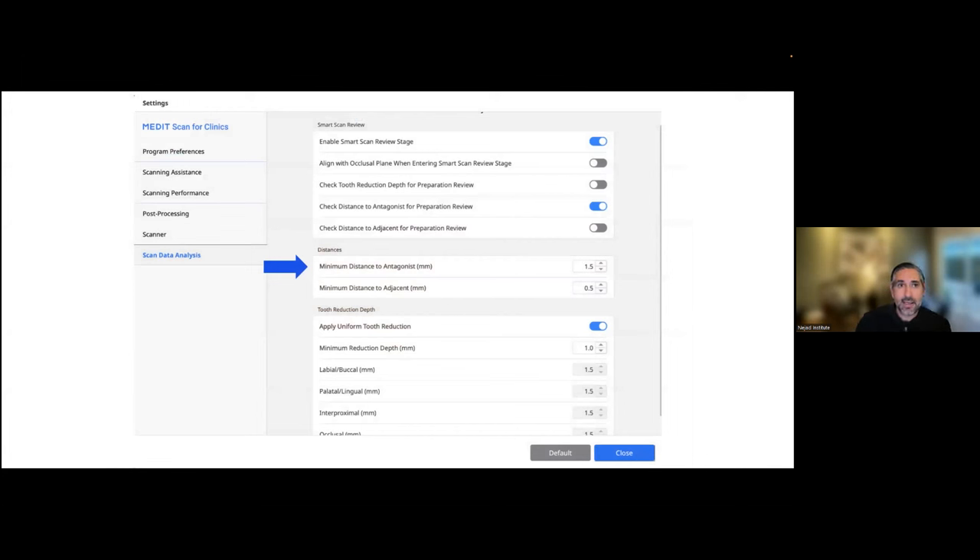You can set a lot of different settings and preferences for this. Under the settings portion of Medit Scan, these are my settings: I want the smart scan stage review, minimum distance to antagonist set at 1.5mm. I like to get that blue highlight showing me all areas, because anything over 1.5mm means I'm very confident I have more than enough space. I don't mind 1.1, 1.2, or 1.3, but it's nice to really see that. You can set whatever you want — the default too. You can bring it down to one millimeter, and you can also check distance to adjacent for contact areas, but I'm most interested in space with opposing antagonists.